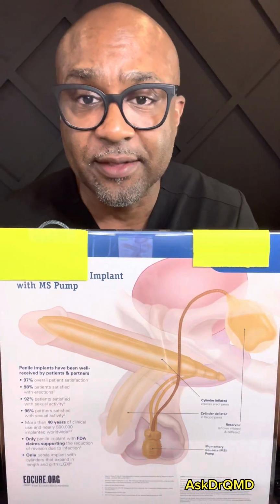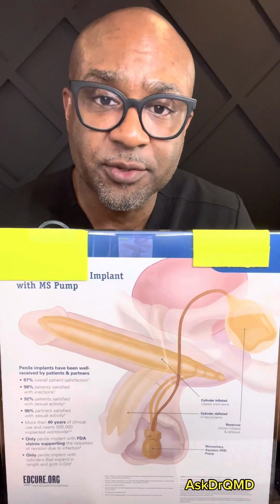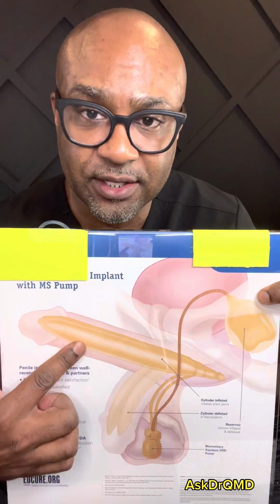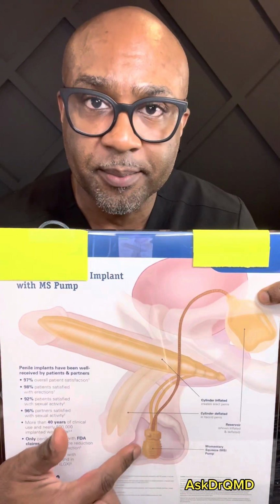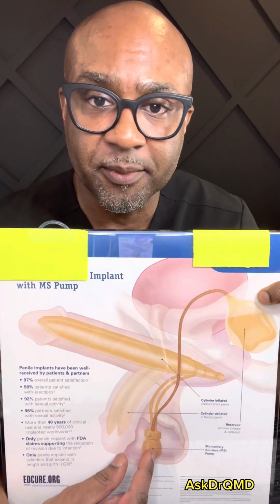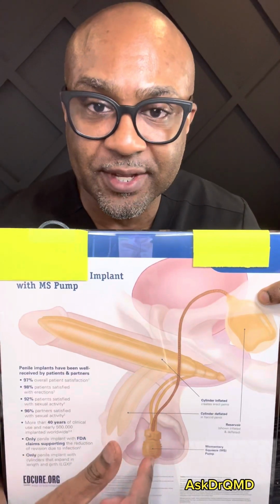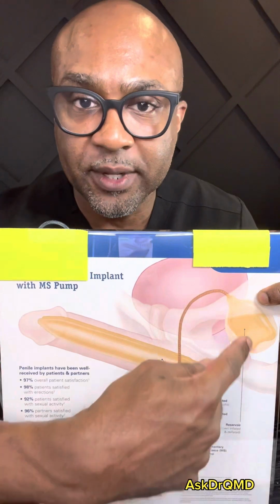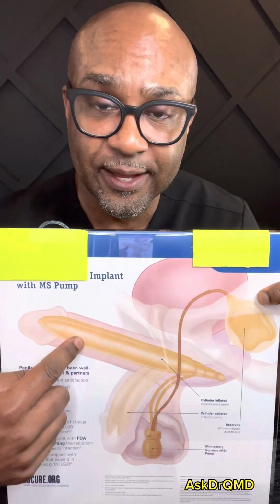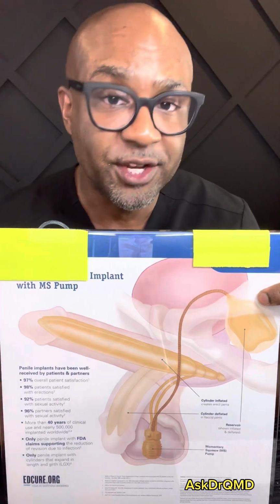And so basically how this works is you are transferring fluid from the reservoir to the cylinders with a pump. So when you want to have an erection, you simply squeeze the pump, which fits neatly next to your testicle, and fluid is being transferred through this tubing into the prosthetic, and you have an erection.